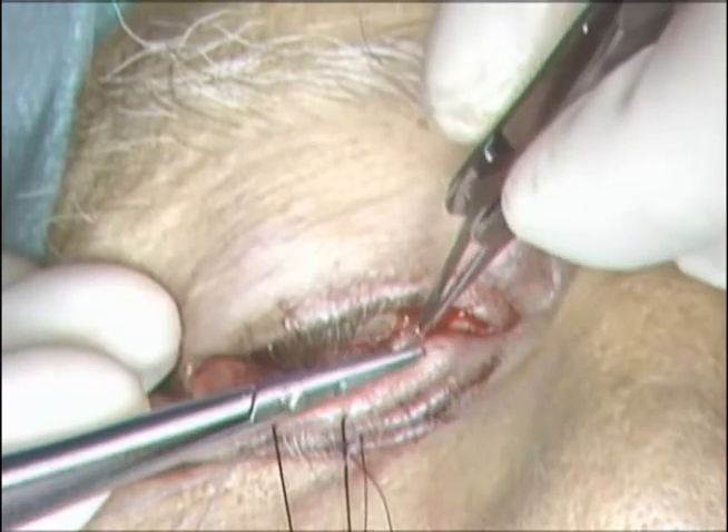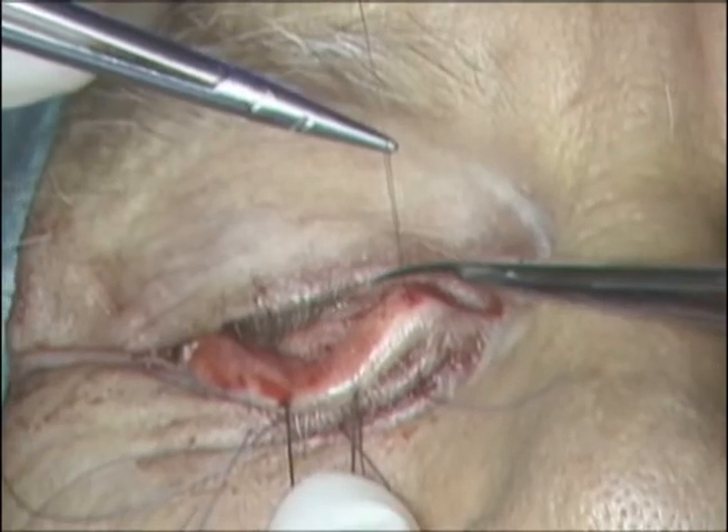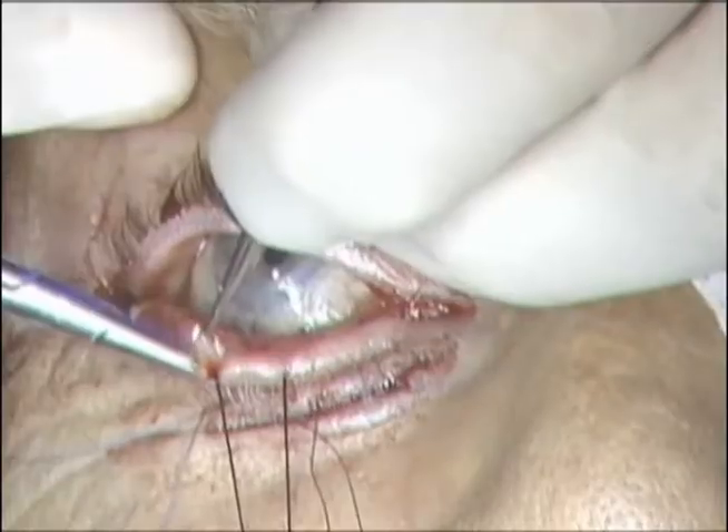The transconjunctival incision is then closed with interrupted or running 7-0 Vicryl sutures. In this case, the sutures are placed in an interrupted fashion.